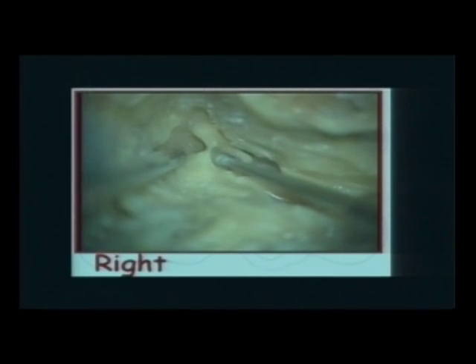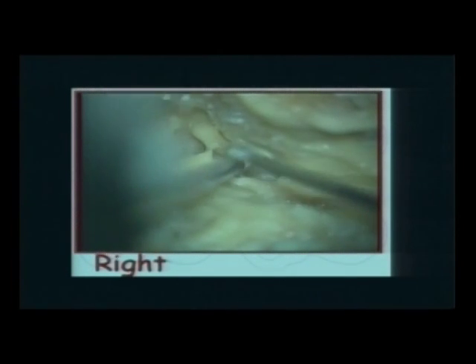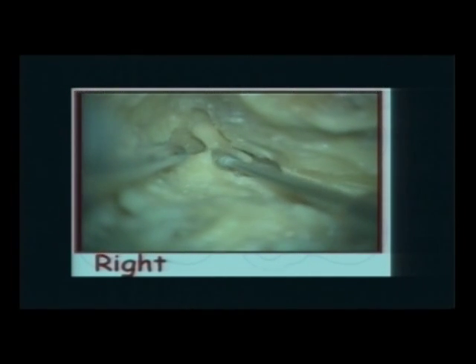Never remove these pieces of bone by pressing down on the nerve. It causes more damage. So you just put your instrument underneath the very thin chip, and you sort of tear it away like that. That's not the way, to push down. No. Just pick up the bone and remove the bone from the facial nerve.